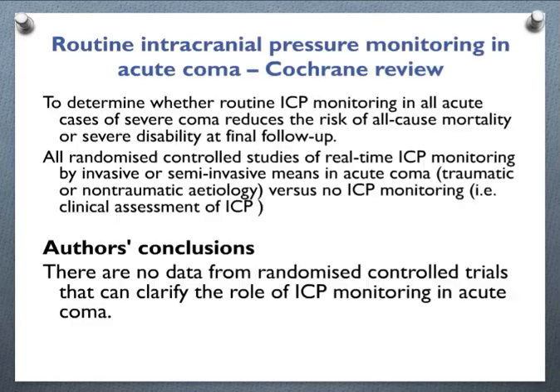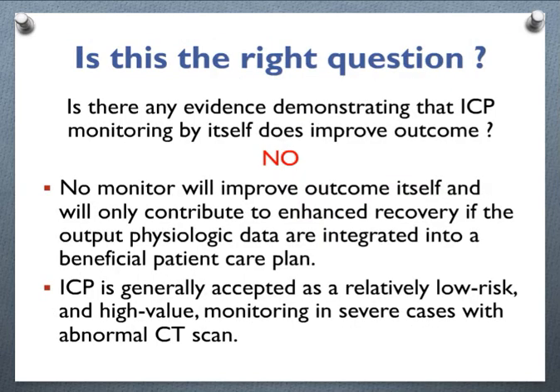And if we take, as in many other topics, the Cochrane review, we know that we don't have any randomized controlled trial that clarifies the role of ICP in acute coma. But I think yesterday Nino presented two papers about ICP that doesn't improve outcome, and sometimes there is some discussion about that. No monitor by itself will change outcome.